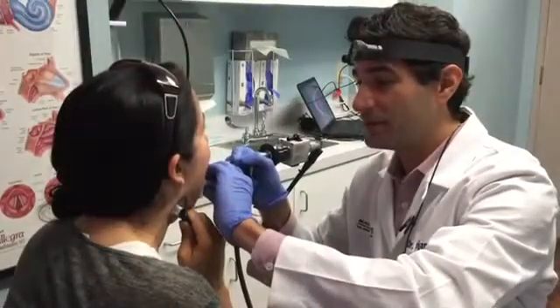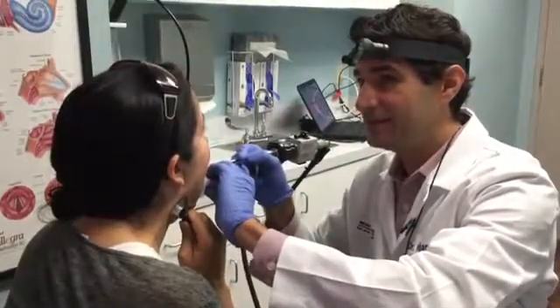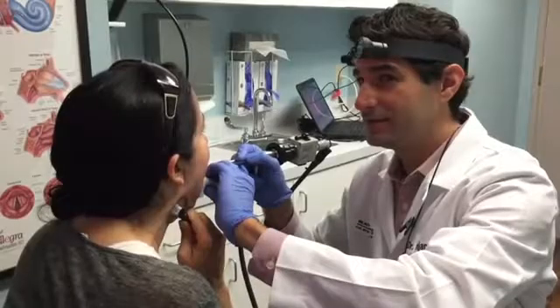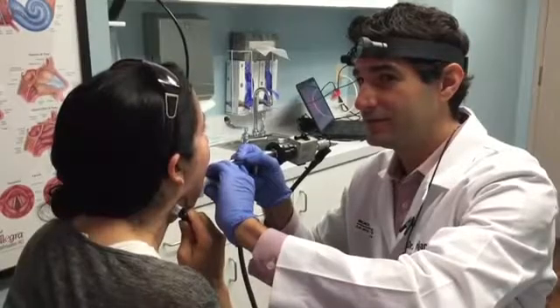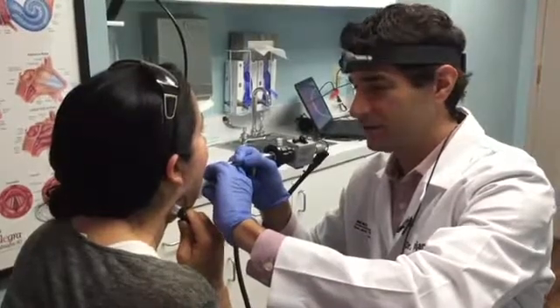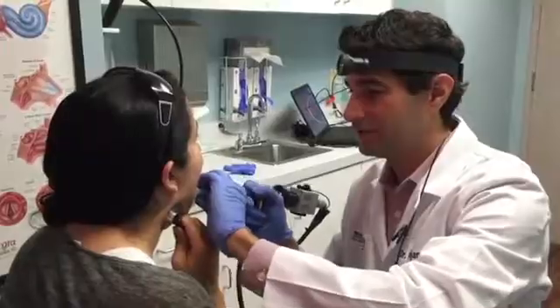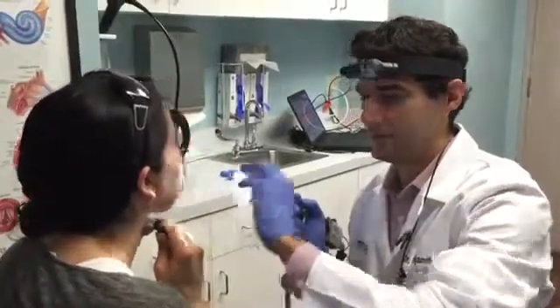Video stroboscopy can be done either through the mouth or through the nose. It takes no more than a few minutes, is generally painless, and requires no downtime or advanced preparation on the part of the patient.